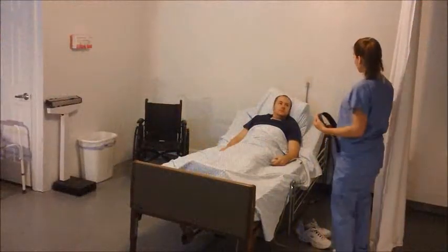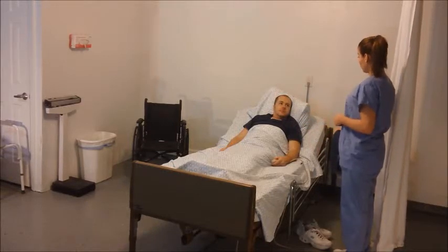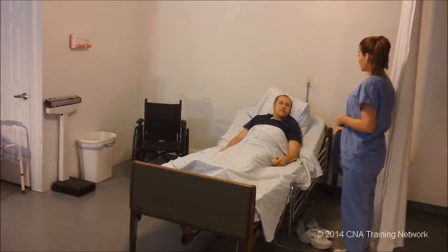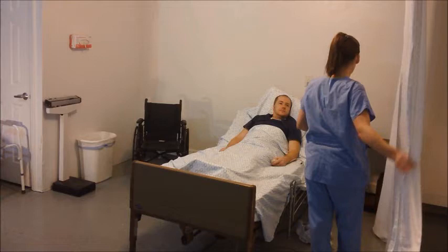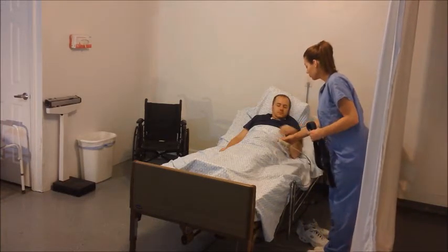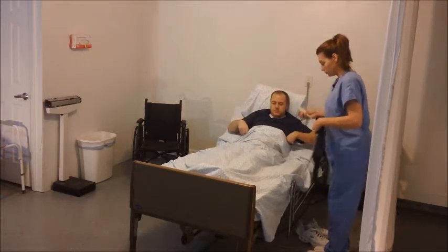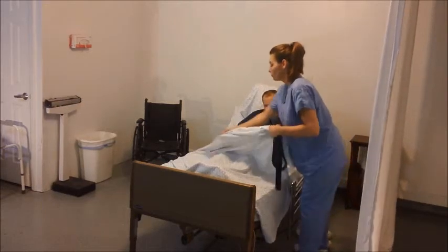Skill checkpoints. Does the candidate greet resident, address by name and introduce self. Provide explanations to resident about care before beginning and during care. Apply transfer gait belt before standing resident, placing around the resident's waist and over clothing, secure so that only flat fingers hand fit under belt, and the belt does not catch skin or skin folds.